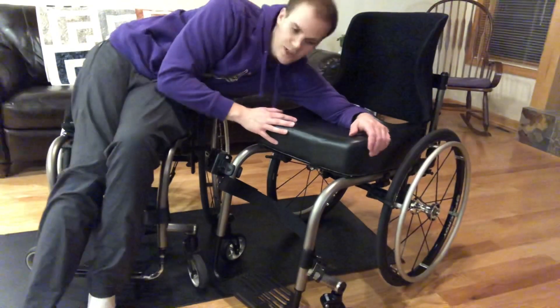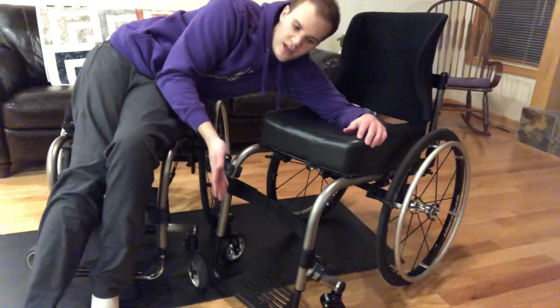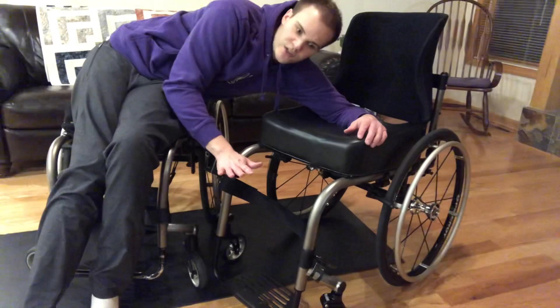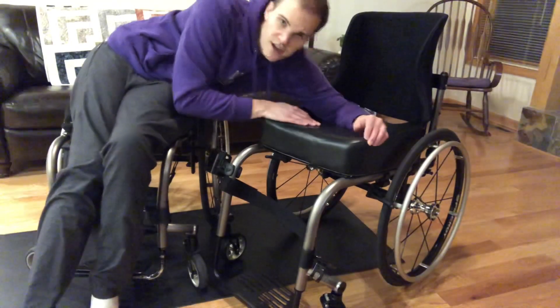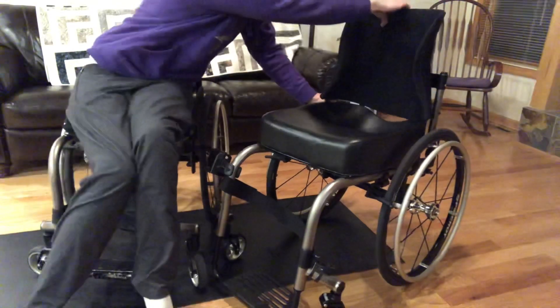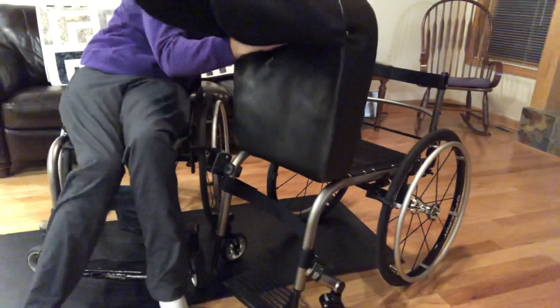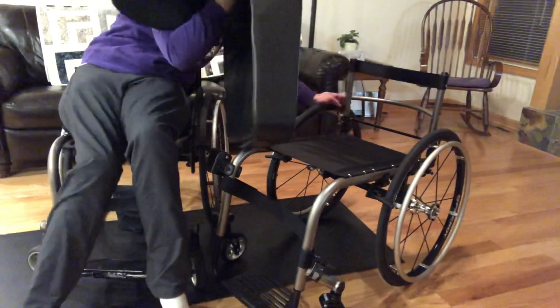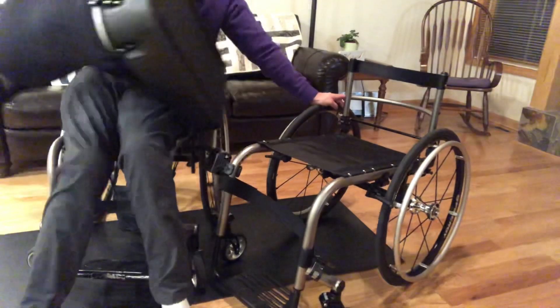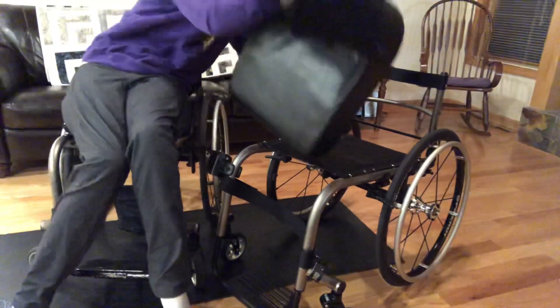I know when learning to do floor transfers, you could take the cushion off of your chair and put it on the floor, sit on that, and then transfer from that elevated position into your chair. But that'll be trickier with this one because that's how my cushion and backrest comes off — it's all one piece. That's the brace.